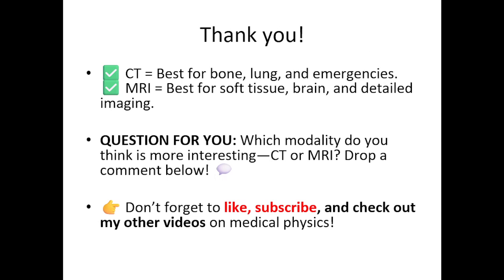So thank you all for watching. And there you have it. CT and MRI provide different types of contrast, making them valuable for different clinical applications. CT is best for bone, lung, and emergencies, and MRI is best for soft tissue, brain, and detailed imaging.